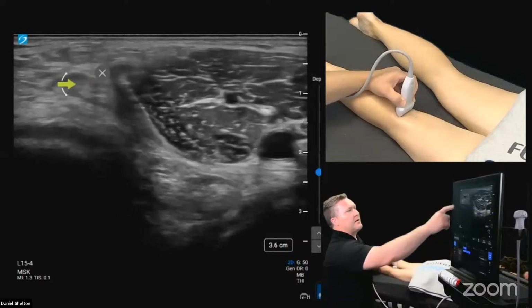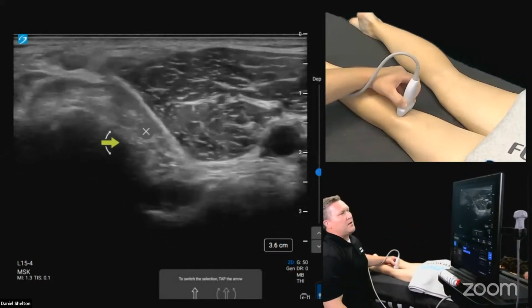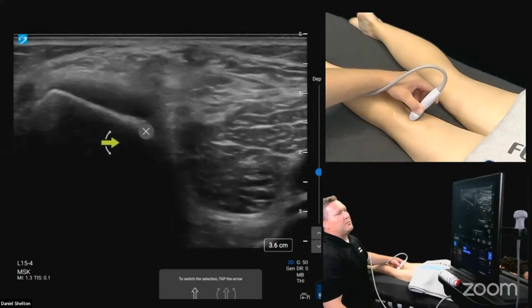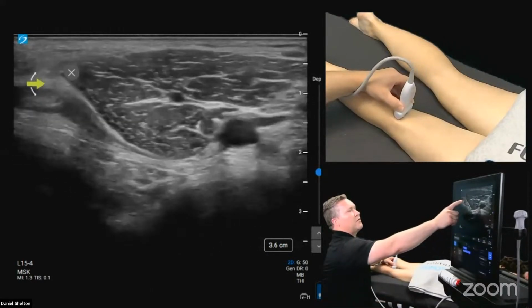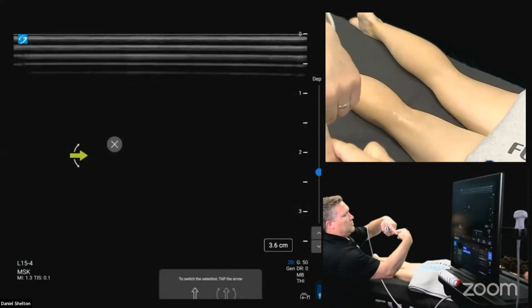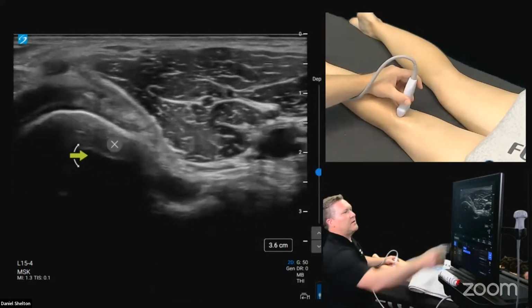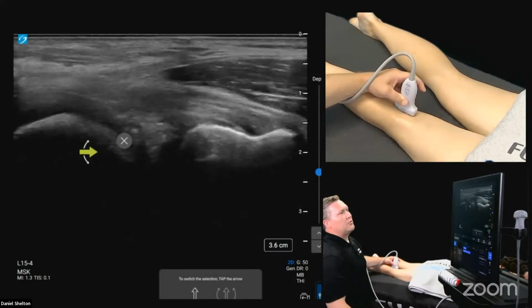let me just kind of illustrate the crisscross nature that we talked about in the slides right here. So the gastroc is diving at this point to the medial femoral condyle at its origin, right? And then the semimembranosus here is diving to go to its distal insertion on the posterior tibia, and they cross each other right here. So they make this kind of scissor pattern, especially when we go long axis. It's very, very easy to see. So I'm going to take that slice right here, and we're going to go long axis right through that plane, and you'll see the two crisscross.